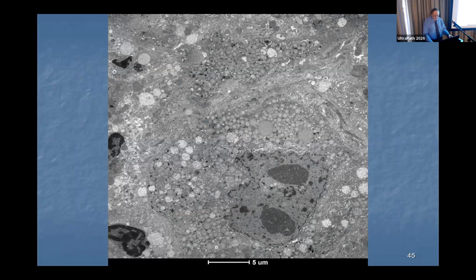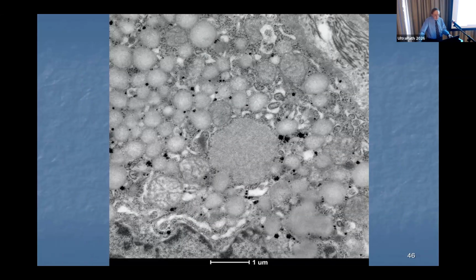And with this, you can see the hepatocytes; this is one that has a binucleate type of appearance. And we see in the background that there appear to be areas that look like a lot of lipid material within this cell. There are a few mitochondria which do not look enlarged or irregular, and we really don't see a lot of glycogen in the background, but chances are the cell has pretty much expended most of its glycogen. But you do see this unique area where there's a really well delineated structure.